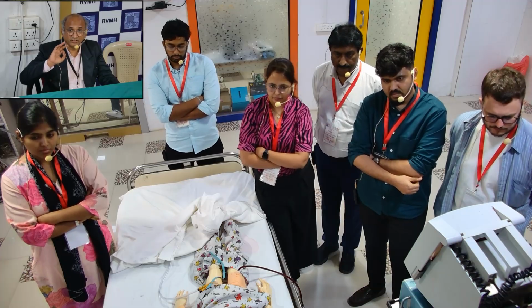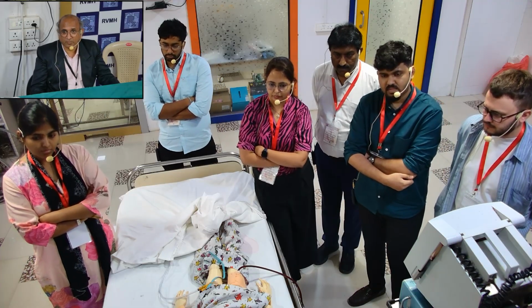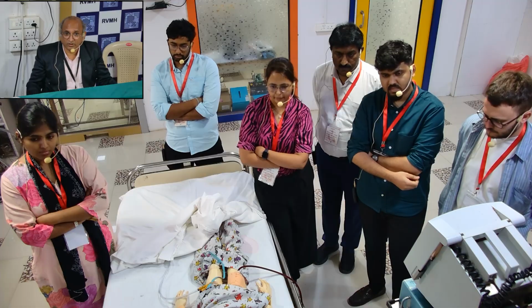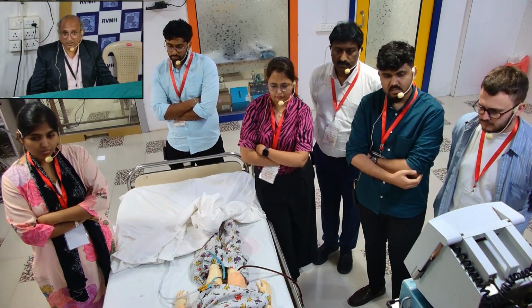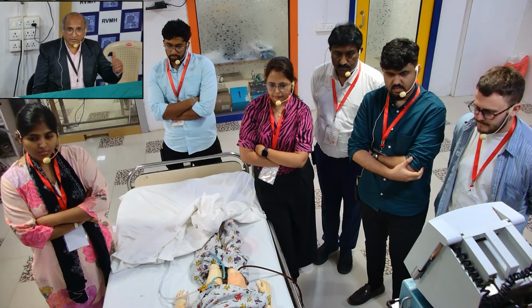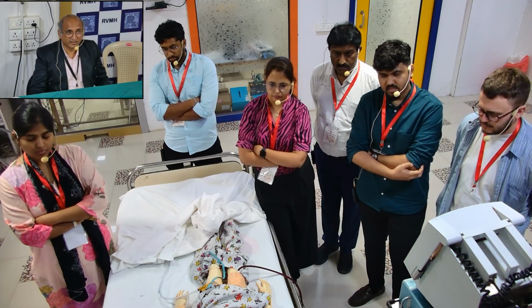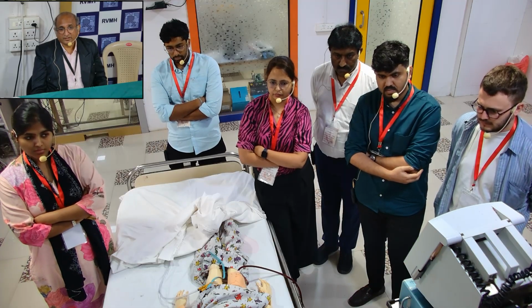Unless the clot is suddenly sitting on the cannula and there is a sudden, complete obstruction of the cannula, you may not see the chattering, because again the negative pressure is not getting transmitted. But otherwise, most of the time you get some chattering when the cannula is getting blocked, and that is probably a dreaded complication. And the management of that is going to be totally different. So whenever you see a sudden change, always look at the circuit first, and invariably you get the answers in the circuit. That is the commonest thing that can happen. Okay. Anything more?